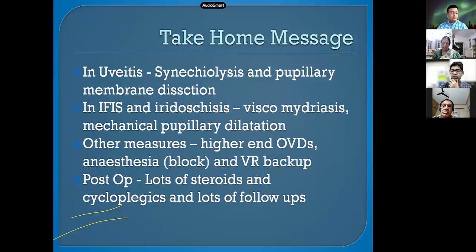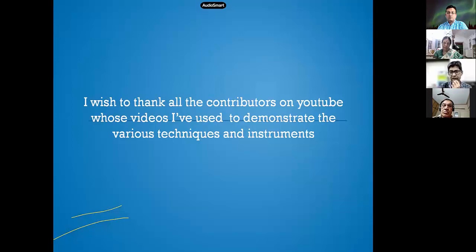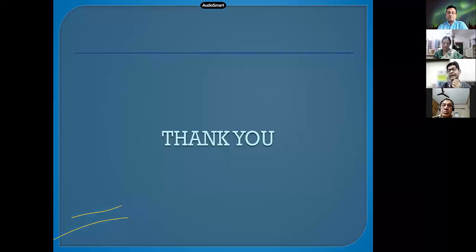You can give a block also. The block itself increases the dilatation of the pupil. And always have vitreoretinal backup because you never know what you are going to face. Post-op, lots of steroids, cycloplegics, and yes, lots of counseling of the patient. That helps with everything. I would like to thank all the contributors on YouTube whose videos I used to demonstrate the various techniques and instruments. I thank you all for your patient hearing. Thank you.